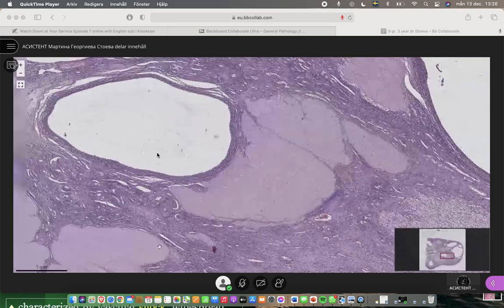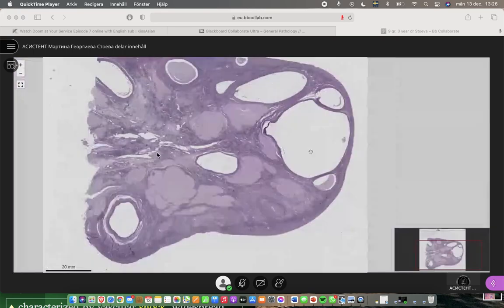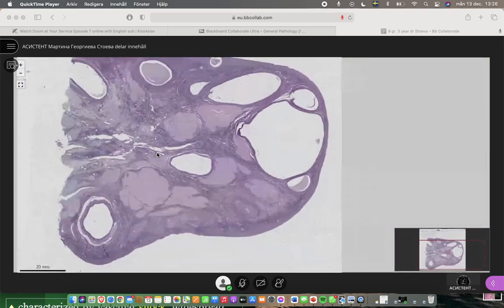You know that in between the ruptured follicle during ovulation and corpus albicans, there is a middle stage of corpus luteum. But unfortunately, here on the slide, we can't find corpus luteum to show you how it looks histologically. Maybe here there is something, but this is an end stage, not the classic manifestation of corpus luteum.